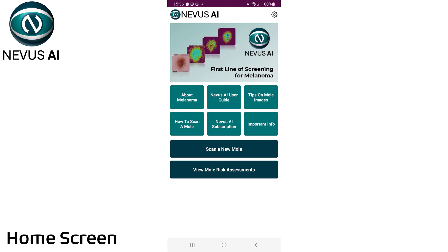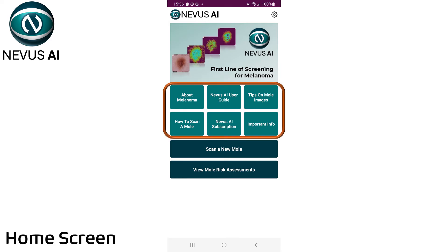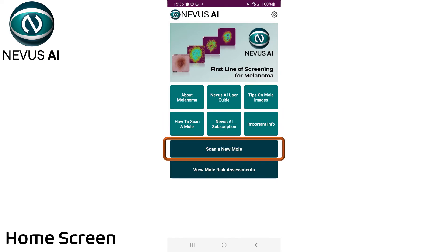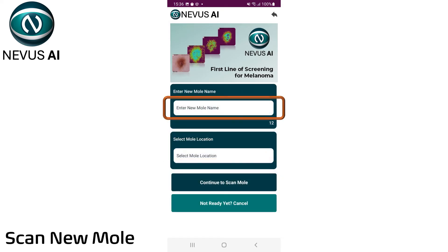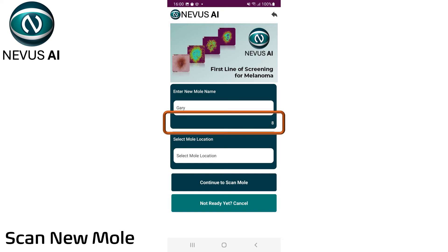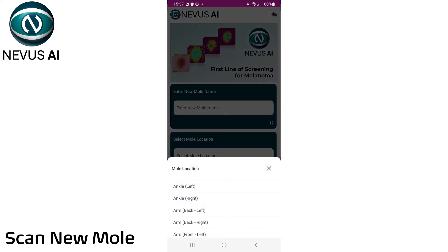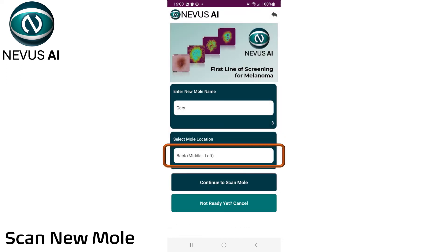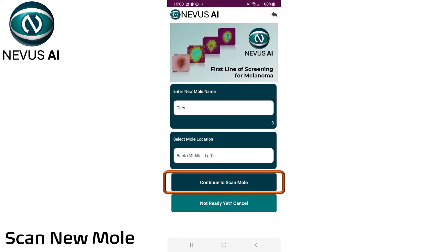After registering and logging into the app, you are presented with a home screen. Read the user guide and other information about melanoma to get the best from Nevis AI. When you are ready, tap on the Scan New Mole button. Give each mole a unique name, and select the location of the mole on your body from the list. Then tap on the Continue to Scan Mole button.